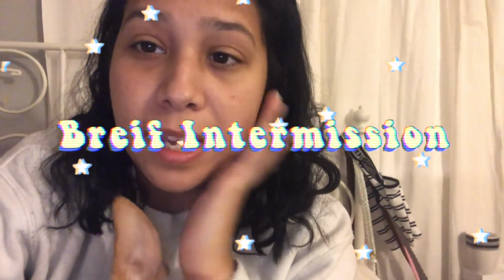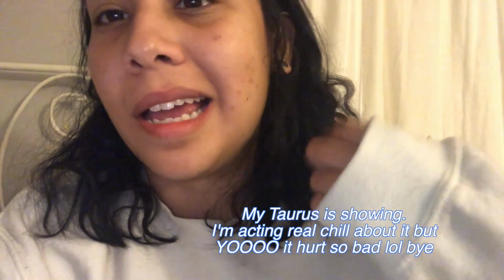So, quick update. I do not have my aligners on because I was told by the orthodontist that if I have cuts and stuff in my mouth, to take them off until the cuts heal because the aligner won't let it heal. So I'm not wearing the aligners today because yesterday I wore them all day. I went to the Renaissance Festival, and I guess from taking it on and off to eat and drink and stuff, I ended up slicing the side of my tongue.